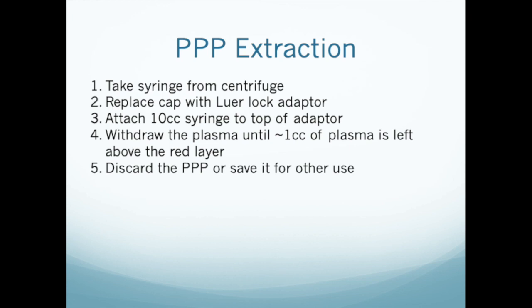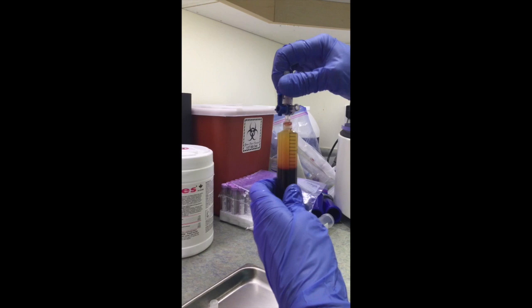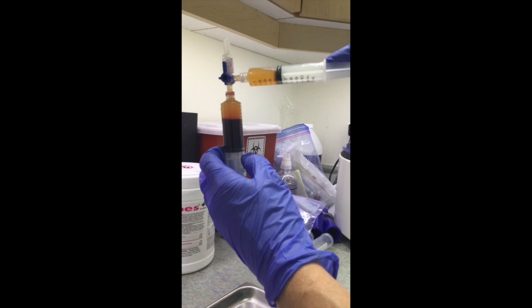Then attach a sterile 10 mil syringe to the top of the adapter. Using the plunger on the 10 mil syringe and keeping a close eye on the plasma level in the bottom 20 mil syringe, withdraw plasma until 1 mil of plasma is left in the bottom syringe. Still keeping the 20 mil syringe upright, remove the 10 mil syringe with the platelet-poor plasma. You may discard it or keep it for other uses.